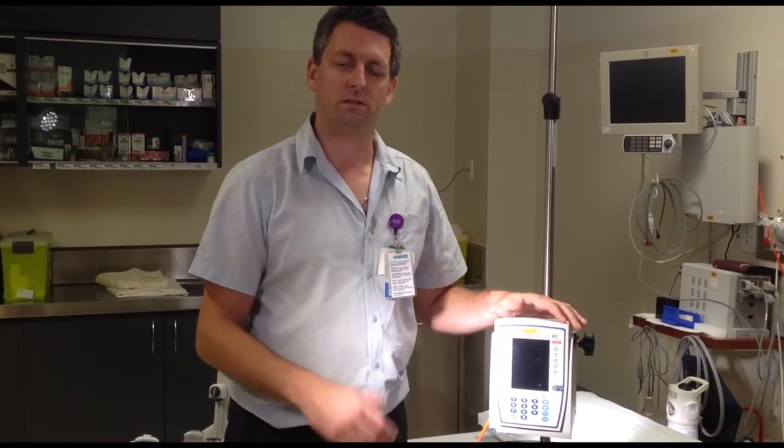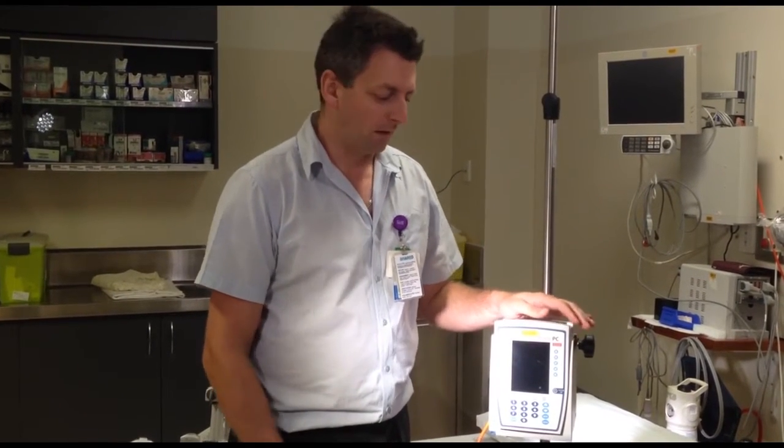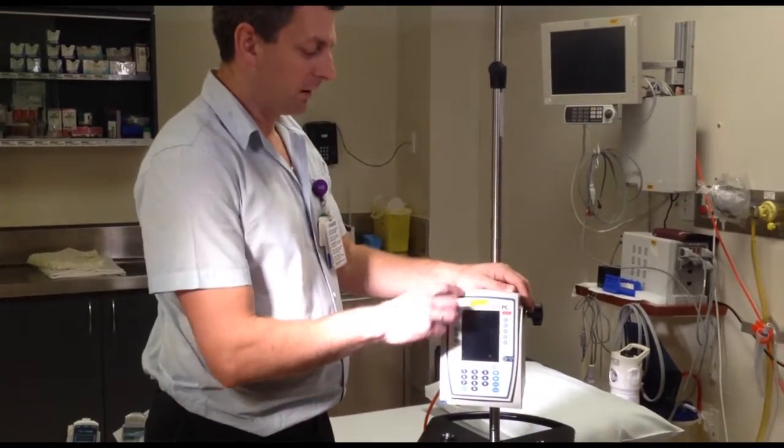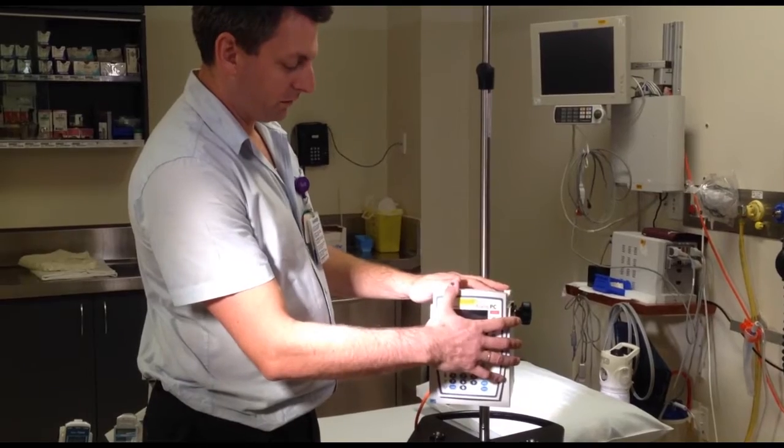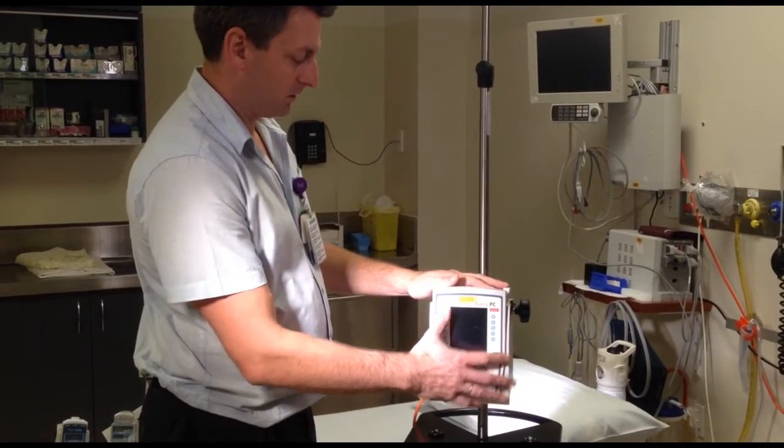Welcome to QNOW videos. Today I'm going to talk about the Alaris pump. It's a modular system and I'll go through the separate modules. We start with the CPU — that stands for central processing unit — and that's what the brains of the operation is.